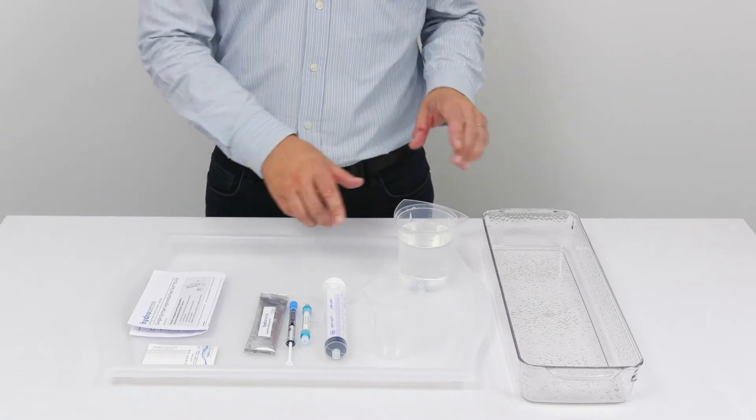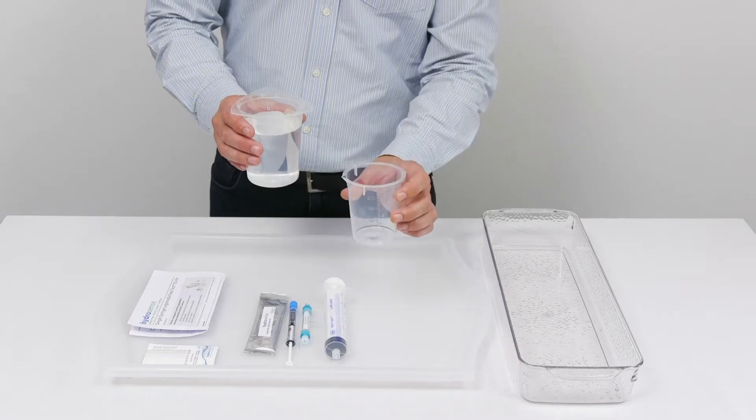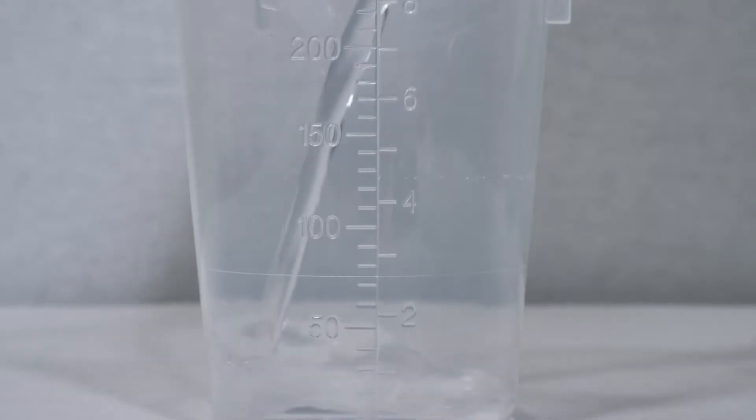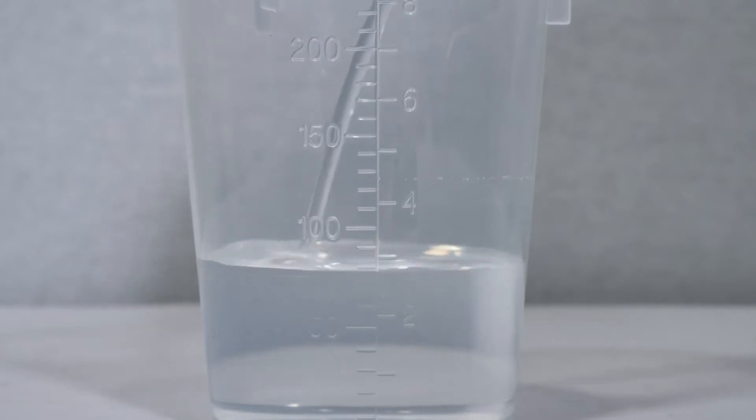I've collected my water sample already, so the first thing you do is take your water sample and pour it into the beaker that's provided with the kit. It's marked up the side of the beaker and you fill it to the 100 milliliter mark.